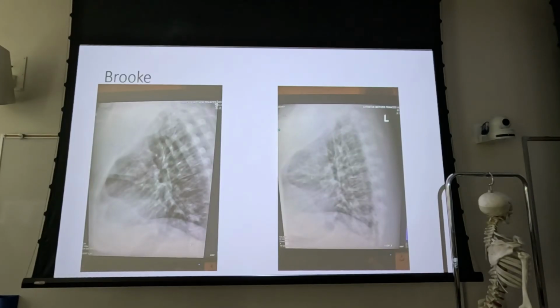So again, know your equipment, and if the patient would be able to fit on a single image, certainly go back and reposition them, put them on a single image. But if your equipment won't fit the patient on the image, shoot for what it is that you missed on the first one, and don't just go back and repeat and repeat and repeat, trying to make something happen that's never going to happen.